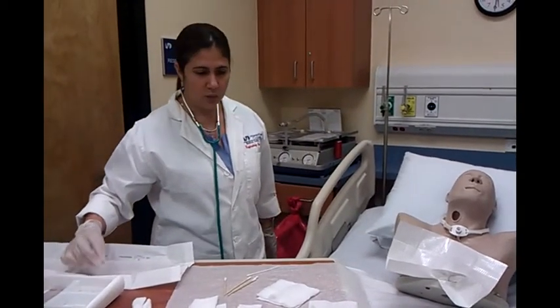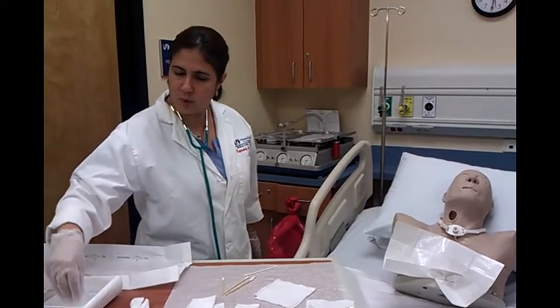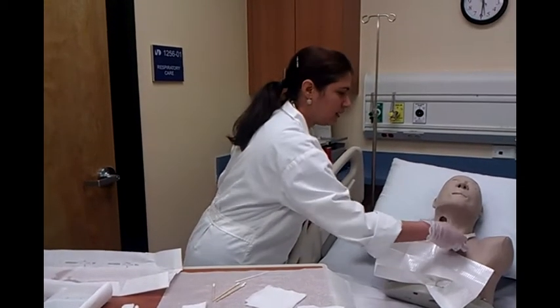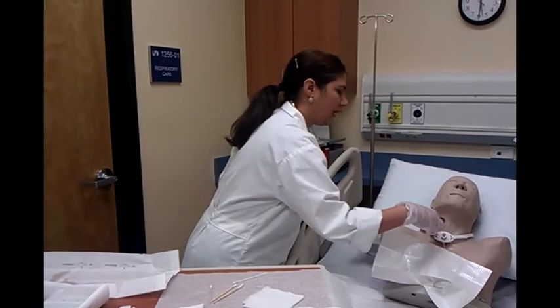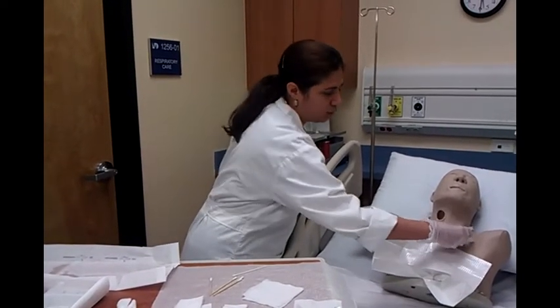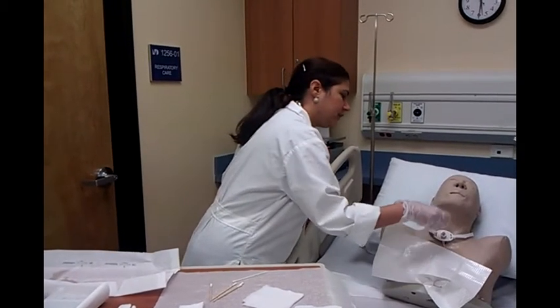I'm going to get one of the gauze, wet it with water, and clean around the stoma, the flange, and the skin to remove all secretion. Also, I have to check the skin, and if the skin is irritated or has any redness, I have to note that when I chart it, and see if there is any smell.